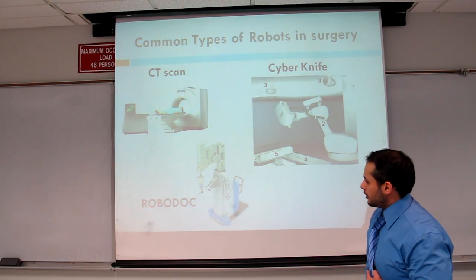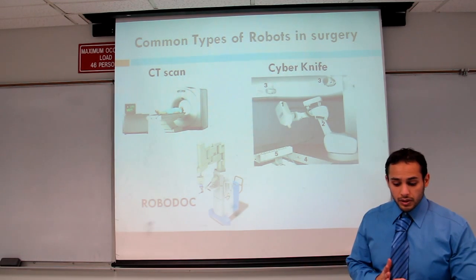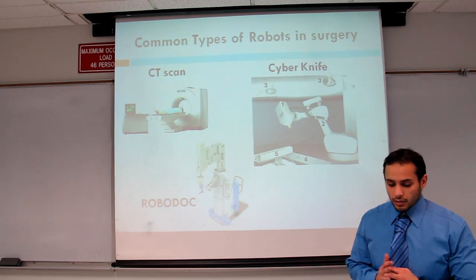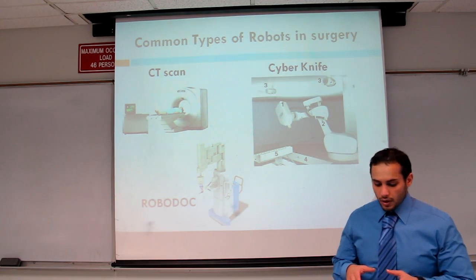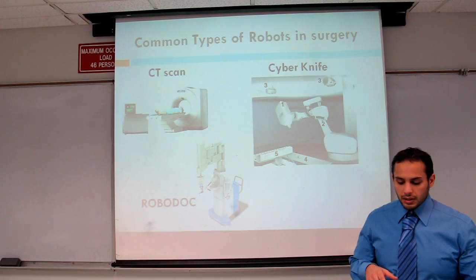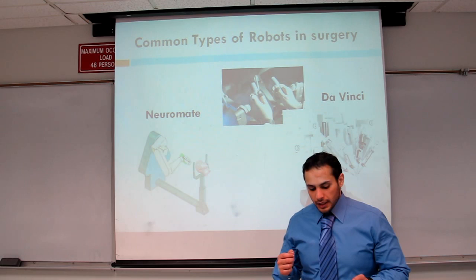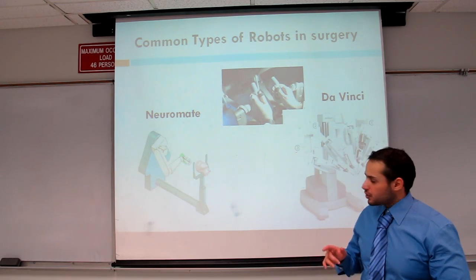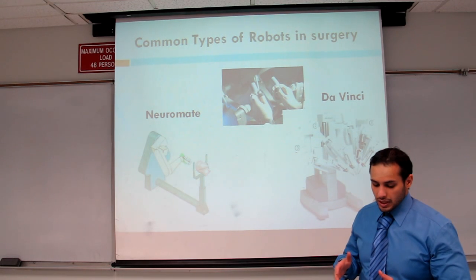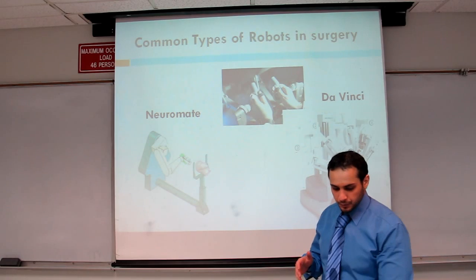The third type we have is the RoboDoc. Curexo Technology Corporation covered the robotics production, since it is used for the bone milling portion of a total hip arthroplasty or any application in the orthopedic field. It is an image-guided system that pre-operatively requires the surgeon to view CT images and select the appropriate implant and its placement.